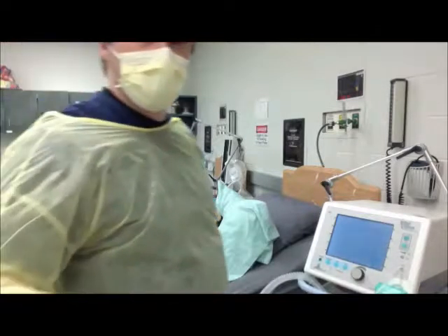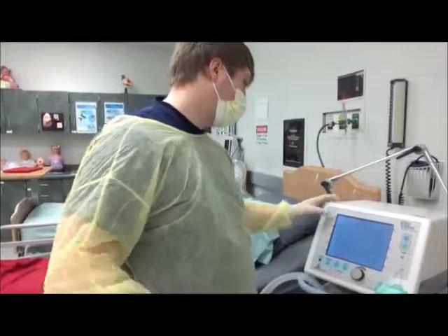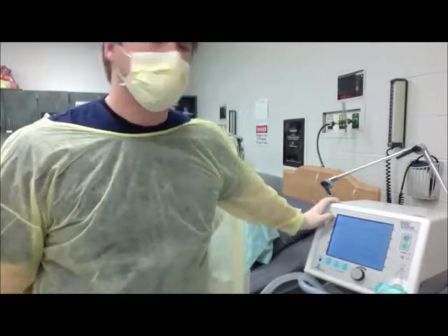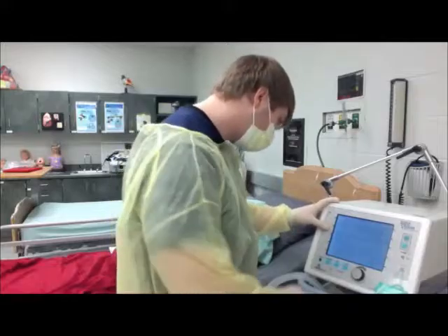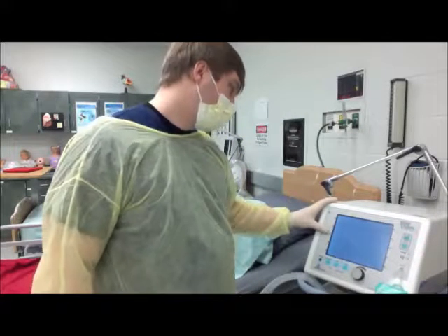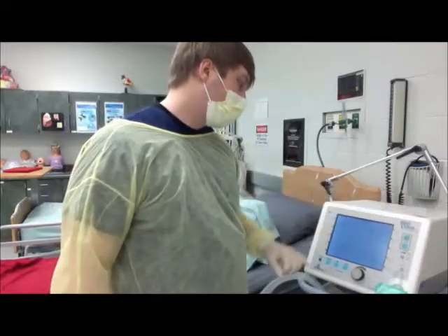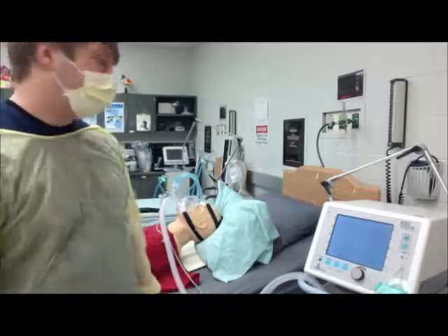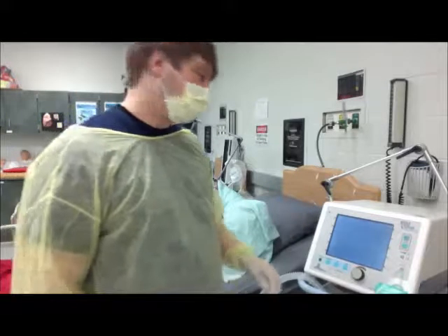So now we're going to do our initial settings. So to start with, we're going to do 10 over 5 and 60%, just to start with. So she's on 10 over 5 and 60%. Now we're not going to keep her on that, we're going to titrate her accordingly as we look at her and look at our volumes and everything.